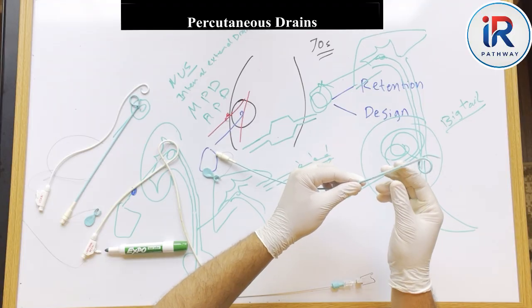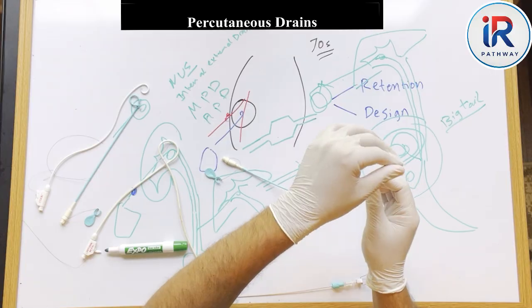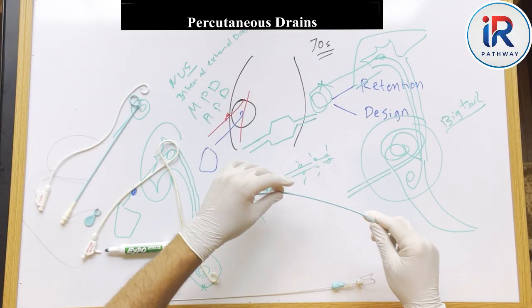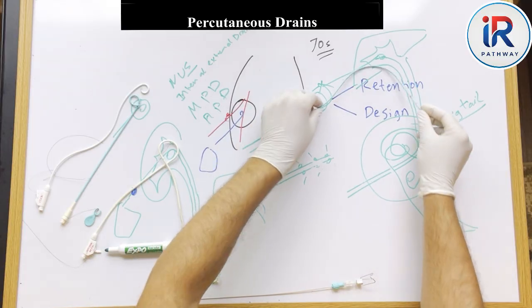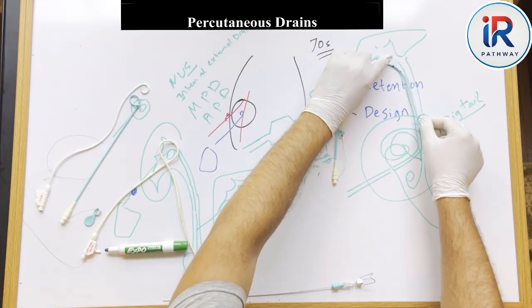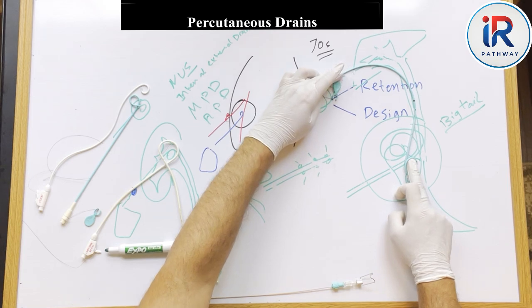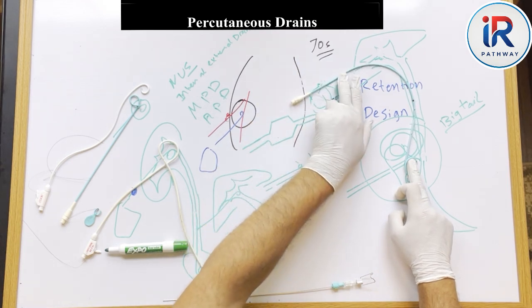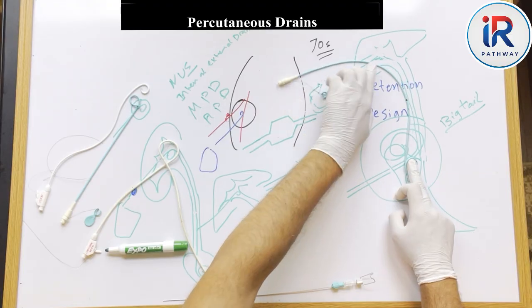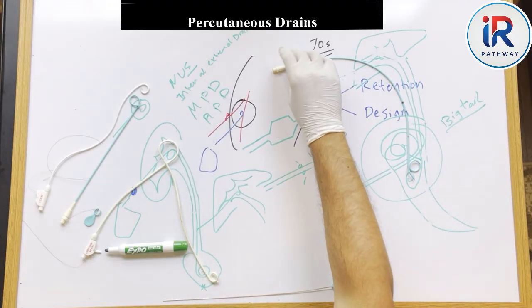Okay, and this is what it looks like. It usually comes with a plastic sheath to strengthen it during insertion. And of course, we will discuss insertion later in detail. But in general, it's a tube shaped this way. And this marker here is usually seated at the access point, and this loop goes down like this. This is exactly how it looks. If the drain is open, fluid exits outside. If it's closed, bile flows naturally into the duodenum.